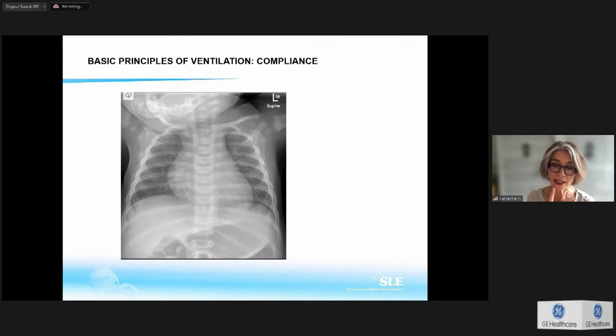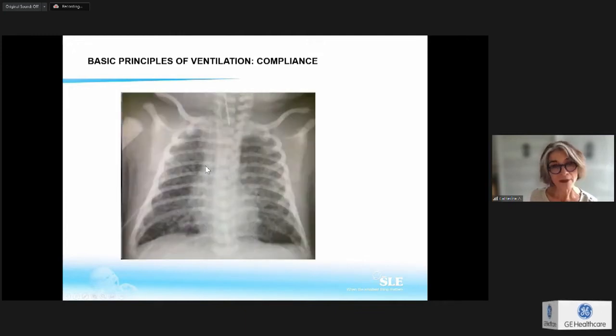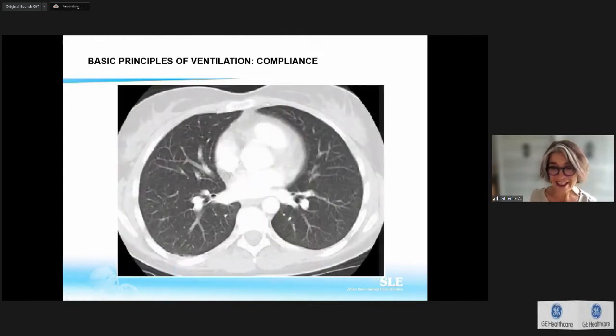Quite often we hear that it is actually a problem of elasticity of the lung. So compliance means that your lung is more elastic, or such kind of thing. It's not exactly true. What happened is this one. Here what you see is a normal lung. If I take this lung like an RDS patient, I know that the compliance is low, but it's not really a problem of elasticity. What I have is this one.